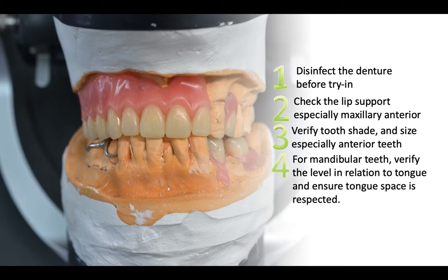For mandibular teeth, you have to verify the level of the teeth in relation to the tongue and ensure that enough tongue space is given. Next, you have to verify the vertical dimension and check for the freeway space. You have to check for occlusion in centric relation and also in intercuspal position. You have to verify for aesthetics and speech, especially for the consonants V, F, and S.